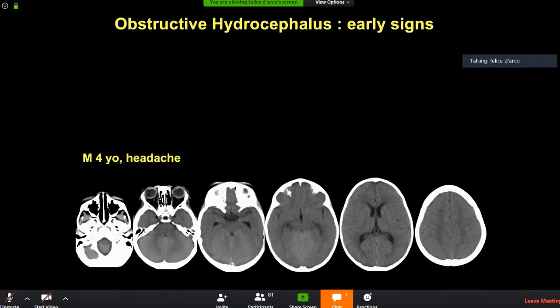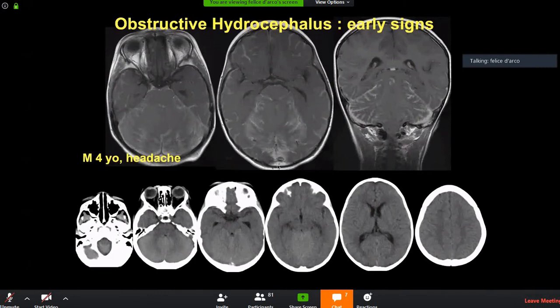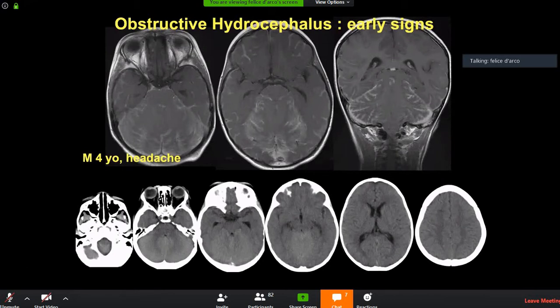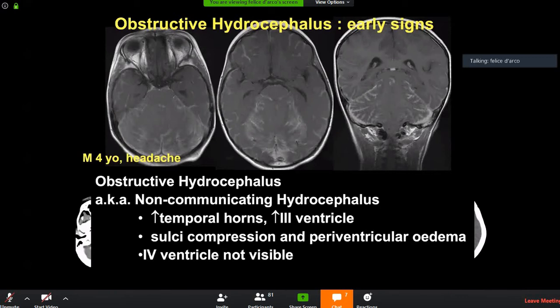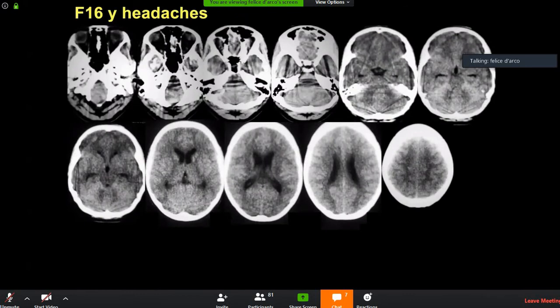This is why you need to do sagittal and coronal reformats for every child CT — just acquire one 3D and reformat. On the sagittal reformat you will see the anterior-inferior bulging of the third ventricle as an early sign of hydrocephalus. Also look at the fourth ventricle — if it is completely gone, that is a critical finding. If you have these early signs, get an MR straight away.